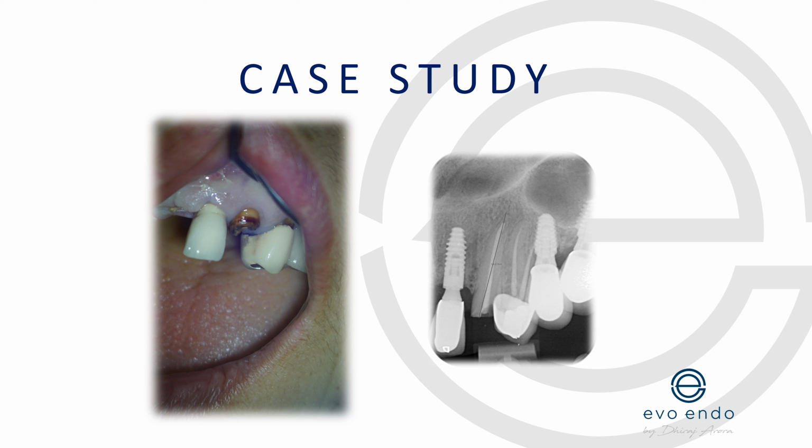And you can see in the picture there are a couple of stitches where she had a couple of implants removed and bone grafting. Suddenly, she changed her philosophy and she believes in preserving teeth, and she wanted me to do anything and everything to save this tooth. We talked a lot about pre-treatment evaluation earlier on, so I'm going to go through this quickly because I think if you plan, you're going to get a predictable end outcome.